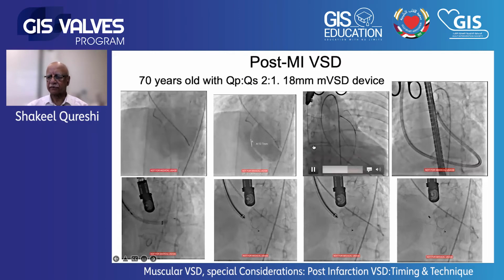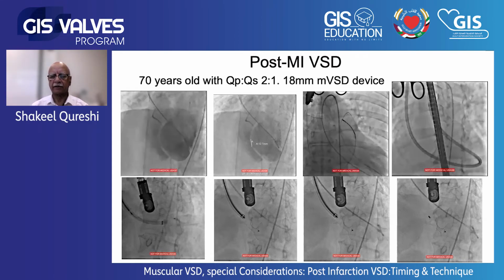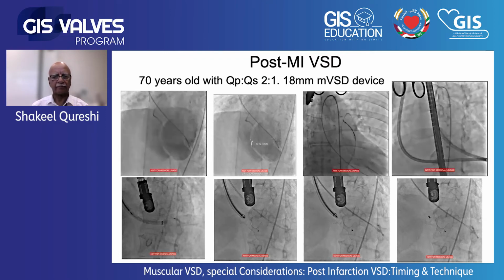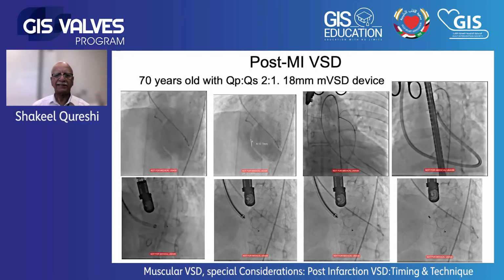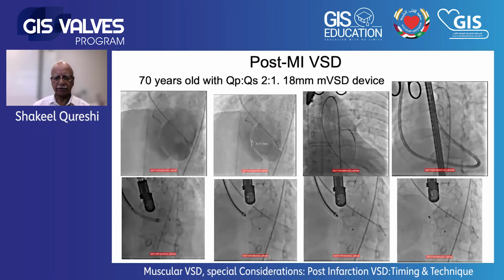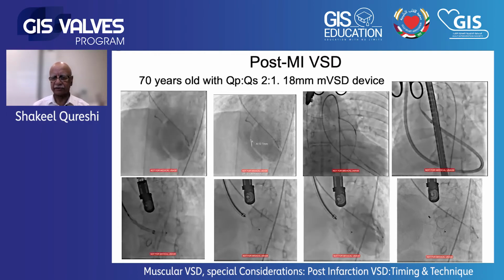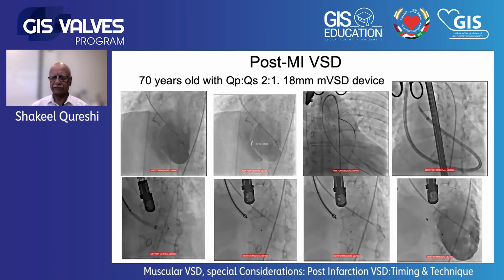In this case, the VSD is crossed from the left ventricular side. The wire, the Terumo wire, is then passed up into the right ventricle and into the pulmonary artery, where it is snared from the internal jugular venous approach, because this is a defect that's a bit low in the septum. And then a sheath is advanced up over the guide wire circuit into the left ventricle. And then the VSD device, in this case for a 13 millimeter defect, an 18 millimeter VSD device, is delivered, gradually opened into position, and then the right ventricular disc is deployed. After check angiograms showing satisfactory position, the device is released. And there's the final angio with a small residual leak through the mesh of the device.